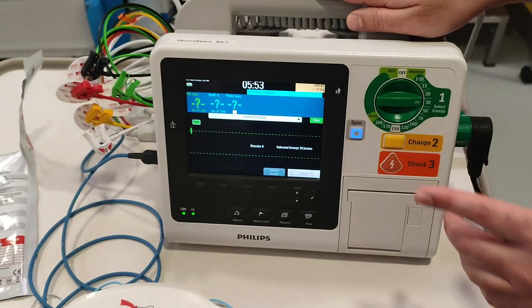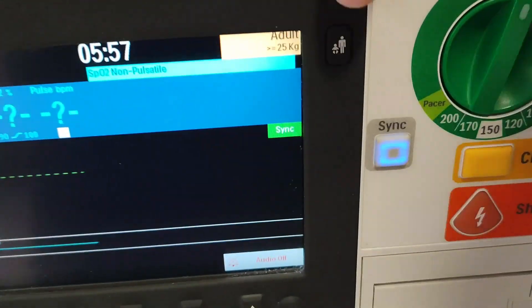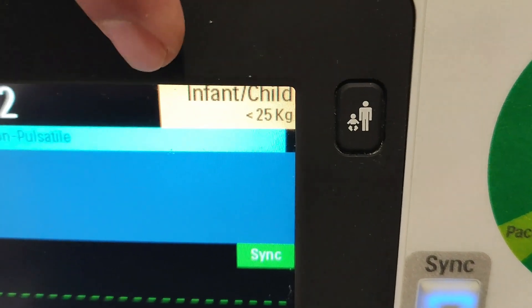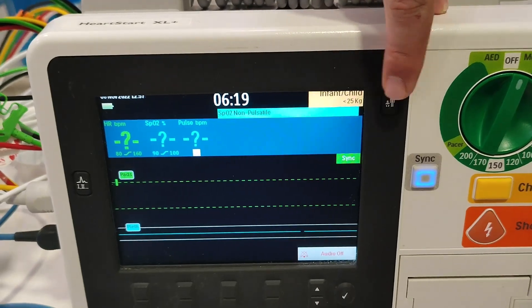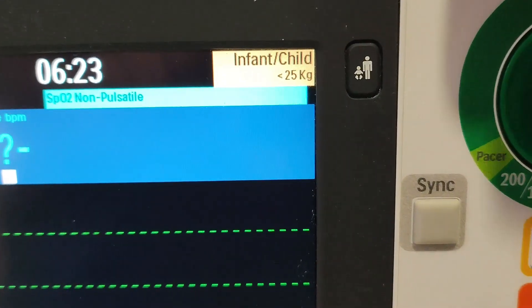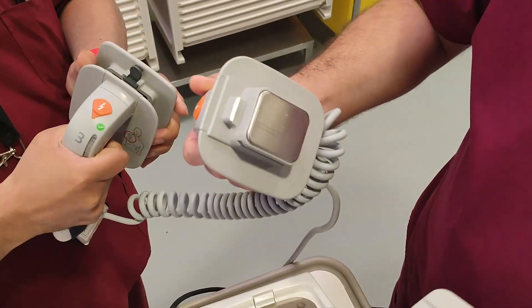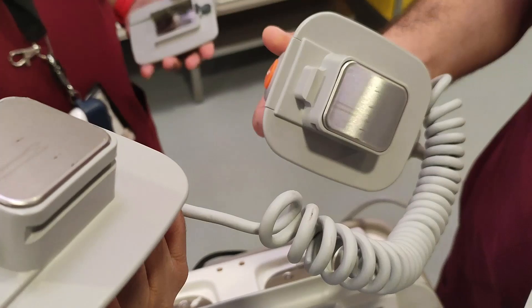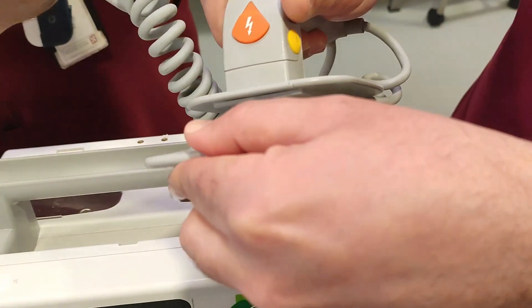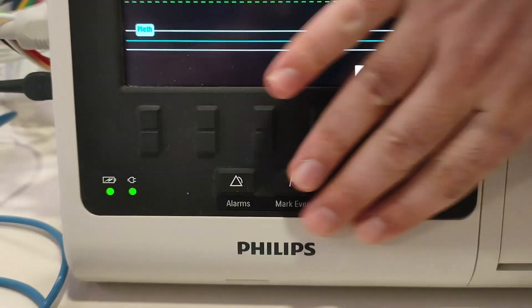For defibrillation you need to do it manually — either from here, from the paddle, or with the pads. There is also an adult or pediatric option. Press this button and it shows you the infant or child mode. This mode is important because if you convert to pediatric mode, selecting higher joules will not be supported, protecting the pediatric patient. You can also use the pediatric pads in this mode.